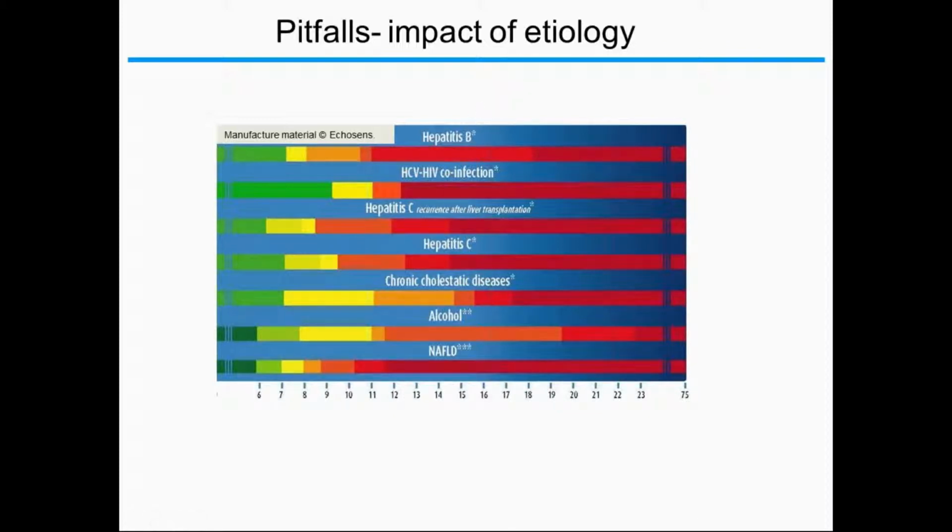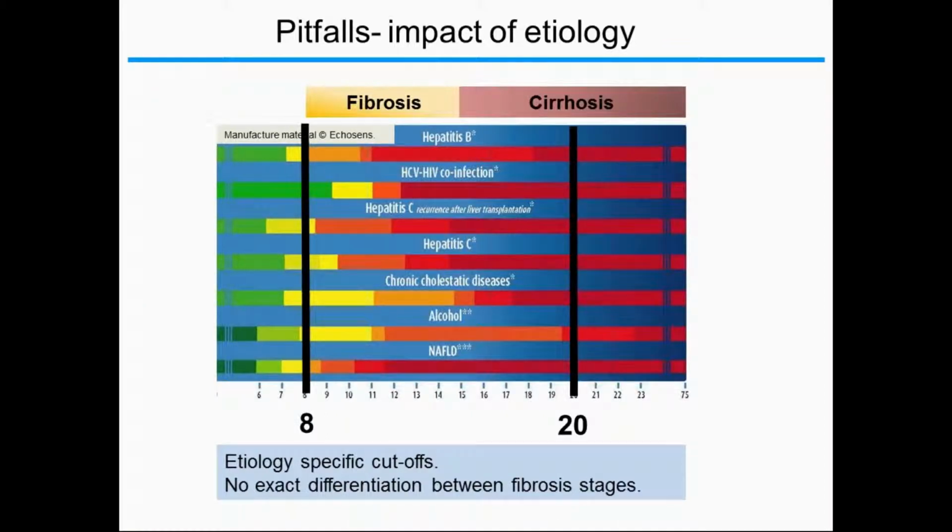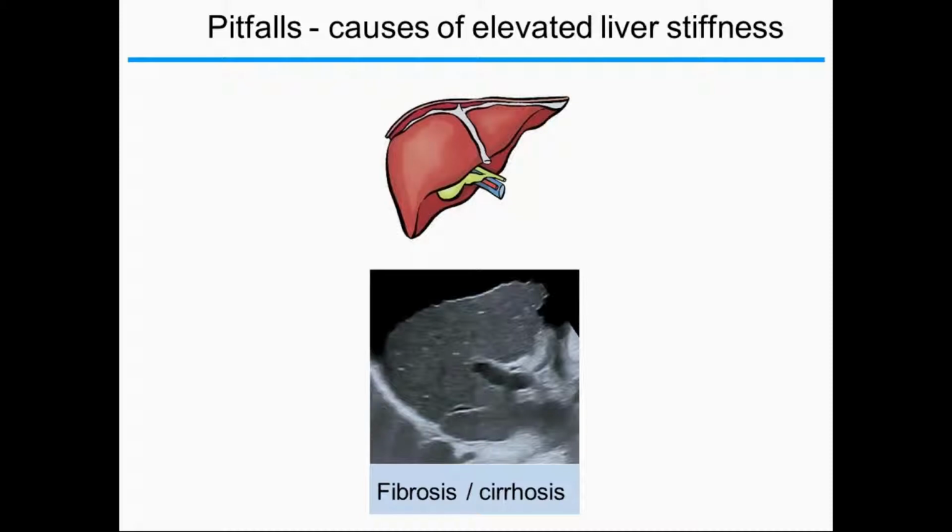As I told you before, liver elastography aims to stage fibrosis non-invasively, and you will find material like presented here, which suggests that fibrosis can be staged very accurately as long as you take etiology into account. But I want to remind you that elastography methods are not precise enough to distinguish single stages of fibrosis, but they give you an impression of the risk of advanced fibrosis and presence of cirrhosis.